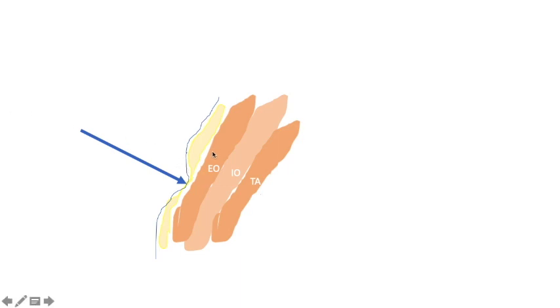When you apply pressure, subcutaneous tissue will be compressed like a cushion, and when it pierces the skin, suddenly it will give way and pierce the skin along with the external oblique fascia. So your first pop will be lost because you have to apply too much pressure. Along with the skin, you will pierce the external oblique fascia and end up going into the internal oblique fascia when you feel the first bounce and pop.